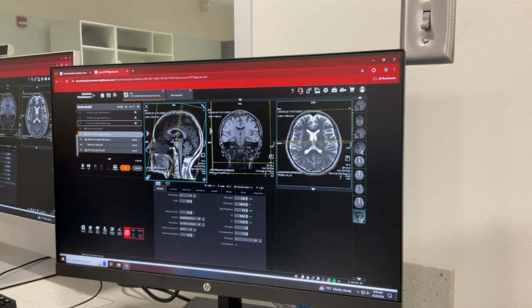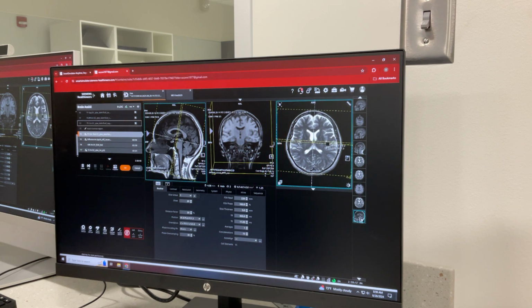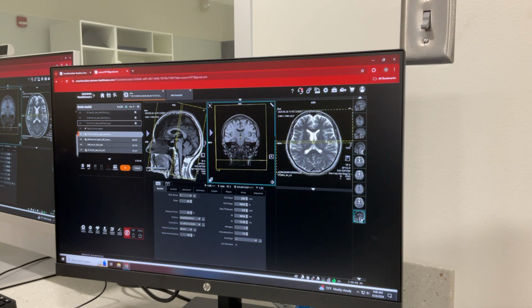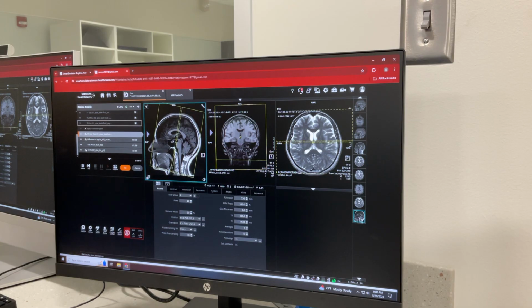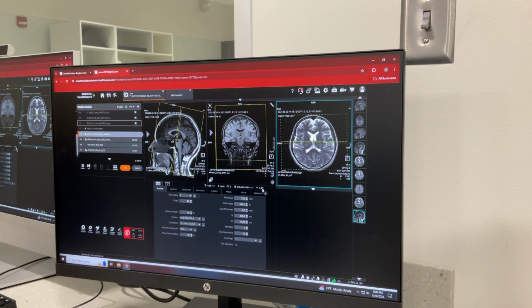And we're gonna use the same number of slices that we used on our pre-coronal image. So when that radiologist pulls up the pre-coronal and the post-coronal, he or she can scroll through them at the same time and be on the same slices, because they're comparing the pre and the post. And we're gonna check our weighting parameters again.